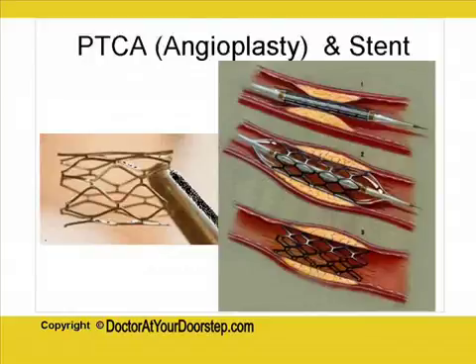So initially we thought about how the results of angioplasty could be made to stay longer. Therefore this particular invention known as a stent came in. A stent is basically a wire mesh which is initially in a collapsed state, and it is inserted into the place where there is a blockage, and there it is inflated just like a balloon.